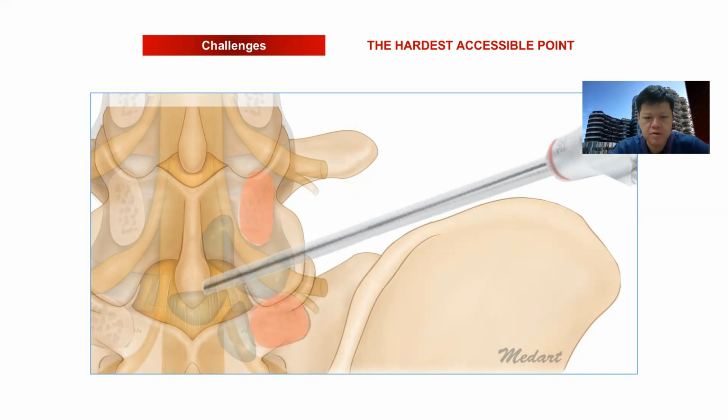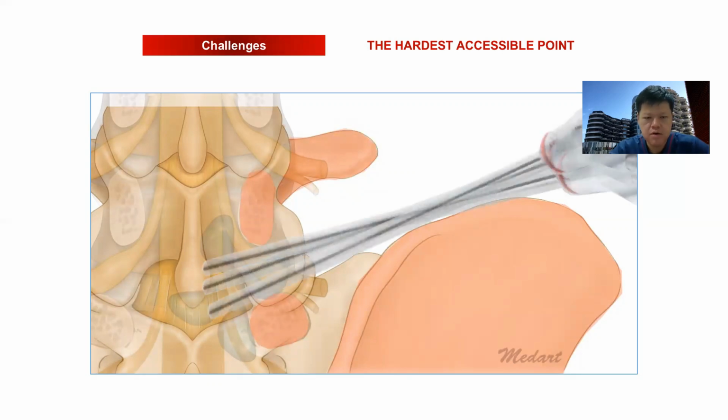One, the interpedicular distance in L5S1, although it's wide, is at an inclination due to the presence of the iliac crest. The height of the iliac crest really dictates the caudal inclination that we can give in the endoscopic transforaminal approach. At times, the large TP and large ala further limit this window for the scope to manipulate. So I find that caudal migration, central migration, foraminal disc, and extraforaminal disc are easier than upward migrating disc in the transforaminal approach.